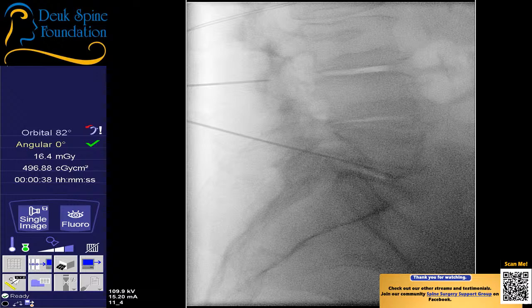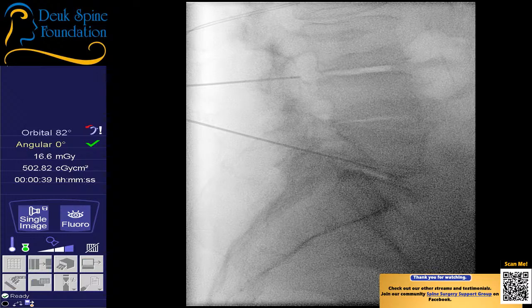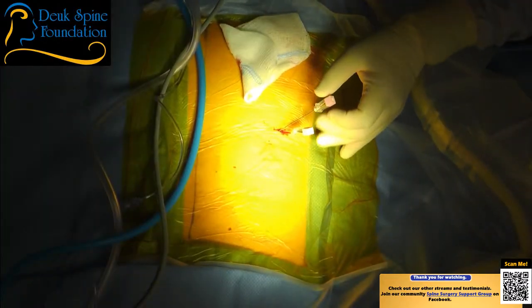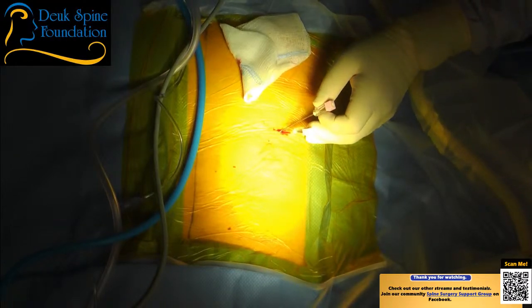I'm on the facet. I rotate, deflect. It's really not a forced technique. This is a very delicate technique, by the way. It's really about, there's really no better word other than finesse. You have to finesse the needle to the exact spot.